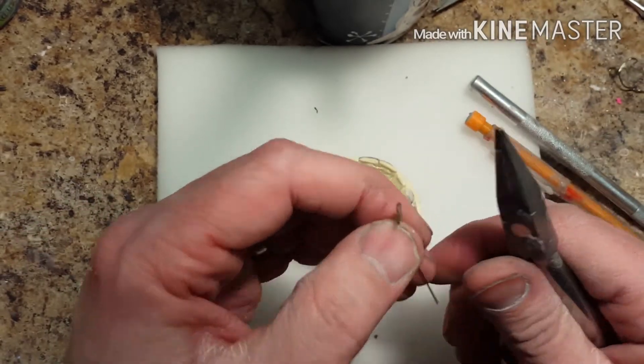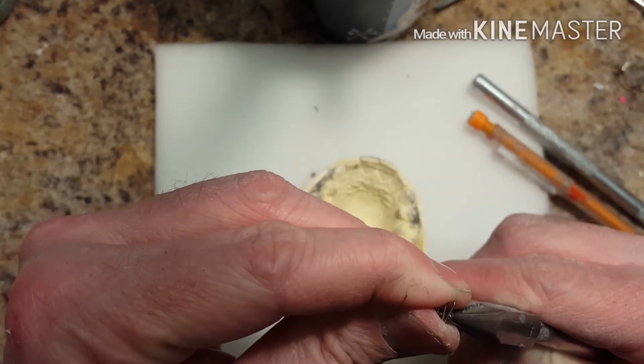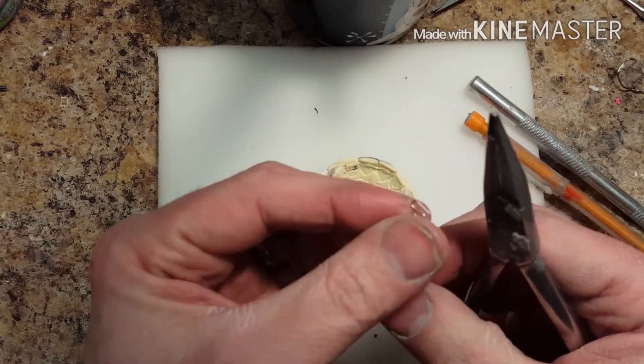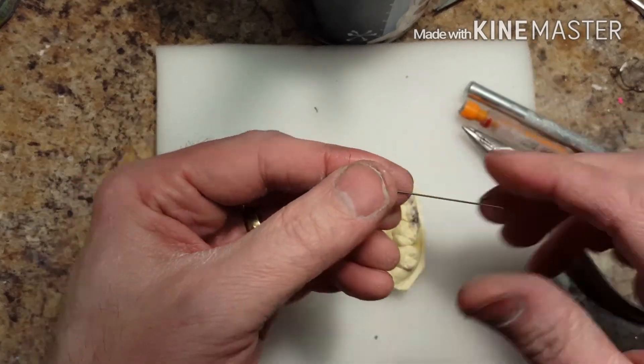I like to make the S-Spring nice and closed. The loops are nice and closed just so it allows the doctor to be able to pull the spring out and allow more movement for the tooth.